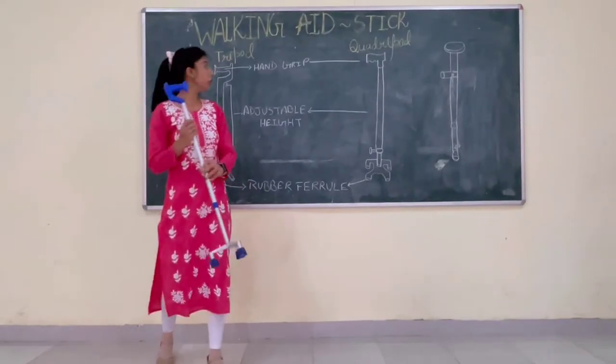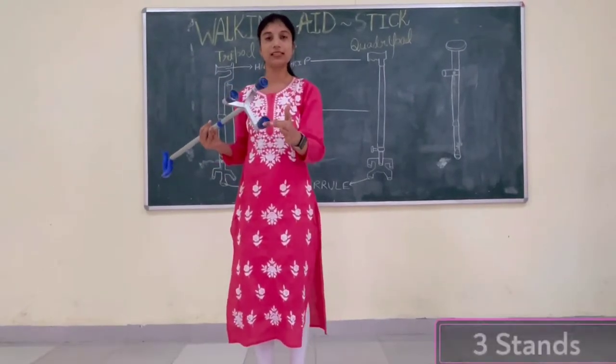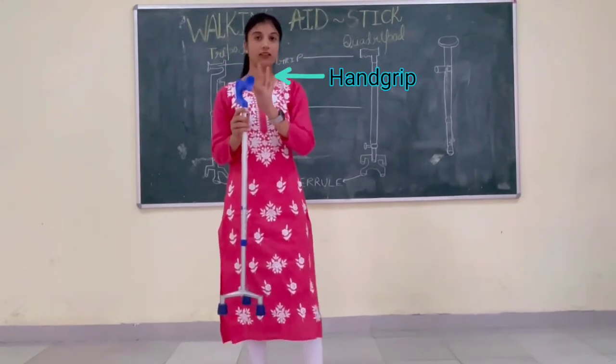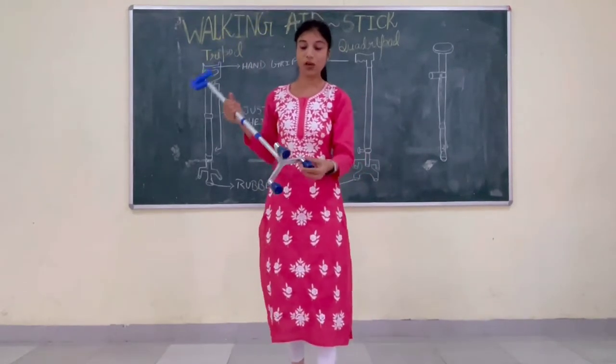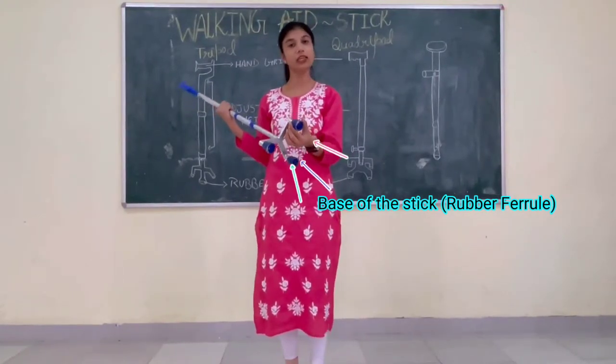Here I am going to show you — this is the tripod stick. Why is it called the tripod stick? Because it has three stands. This part is called the hand grip. This part is called the adjustable height or adjustable length, according to the patient. The base of the stick is called the rubber ferrule because it is made up of rubber.